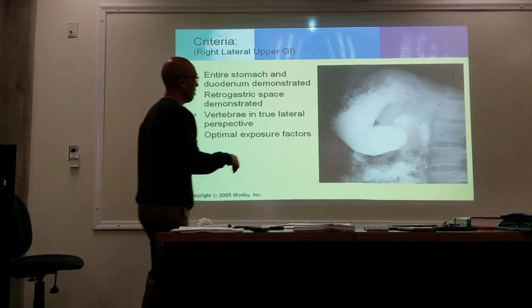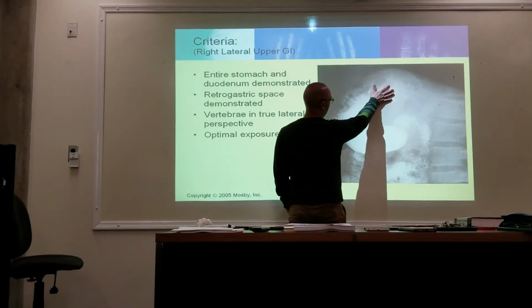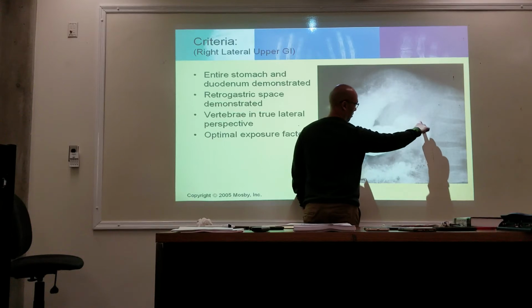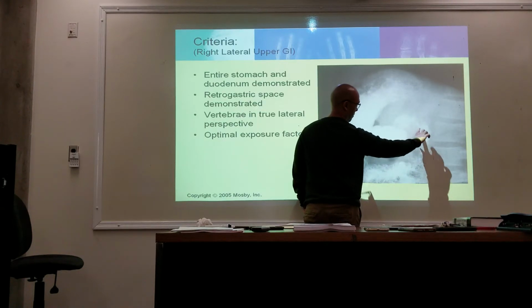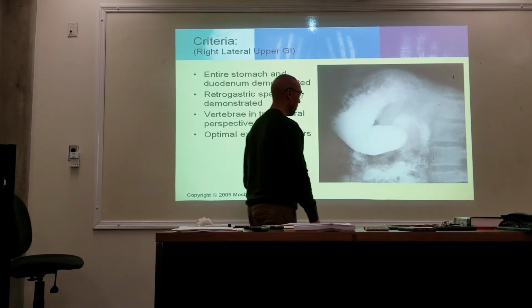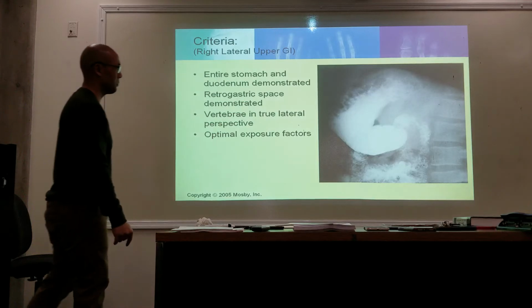So here we have the fundus, we have the body, the pyloric region, the pyloric bulb. What is this area right here? What is that? Duodenum. Okay, and then you see the rest of the small bowel starting to fill up as well.